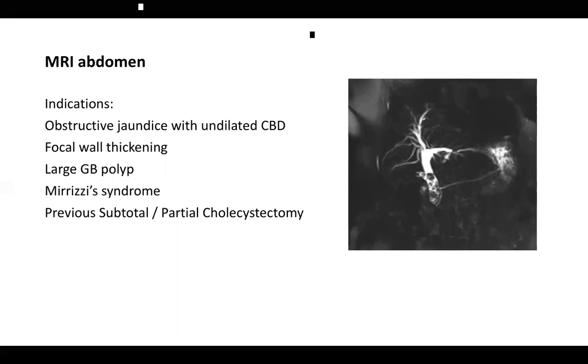that it is a fixed thing that both the surgeon and the radiologist can read. The only clarification that I have is that it is important for the surgeon to sit at the radiology console and go through the axial images and not just the MRCP reconstructed images, for them to pick out the smaller lesions. MRI is also operator dependent to a certain extent, as compared to a CT scan, because the type of sequences that need to be generated has to be told by the radiologist. They need to decide which sequences are needed, when to do T1, when to do T2, when to do a fat suppression, when to do a STIR. But as compared to an EUS, an MRCP is easier to read for the surgeon.